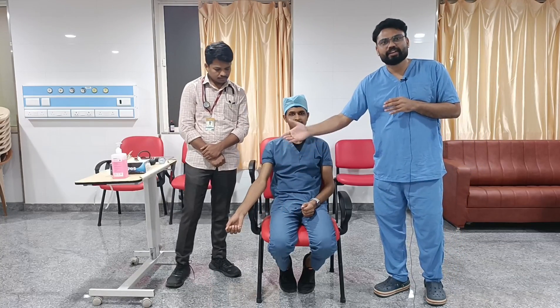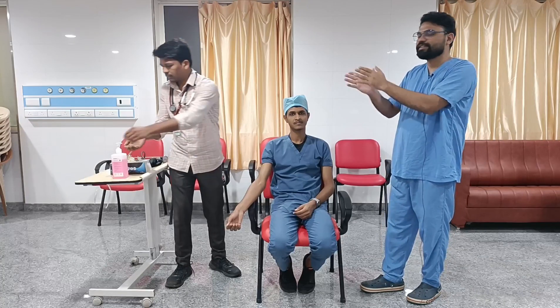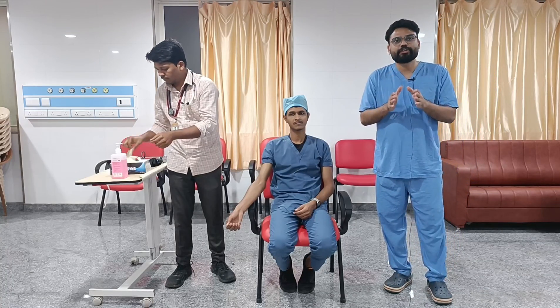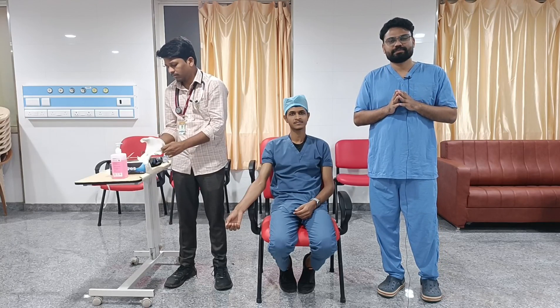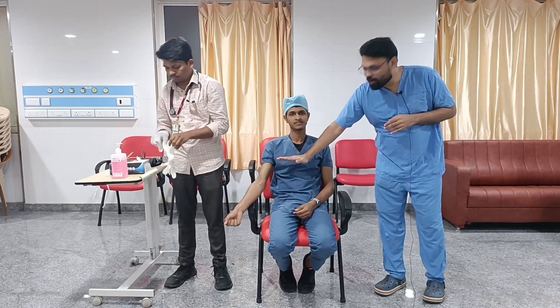Then we come to measurement of blood pressure and the proper technique. The patient's arm should be at a resting position and adequately supported. We need to perform proper hand wash and use gloves before measuring. The BP apparatus should be checked and adequately calibrated. We need to choose an adequate cuff size — the bladder should encircle 80% of the arm. The ideal position for placing the cuff is at the midpoint of the sternum, at the level of the right atrium.